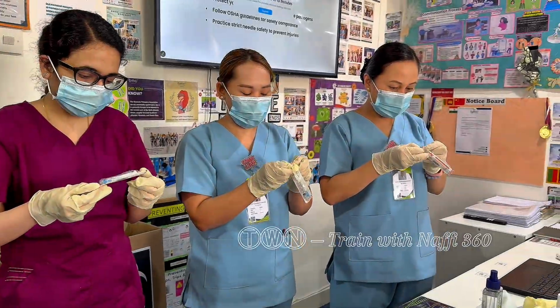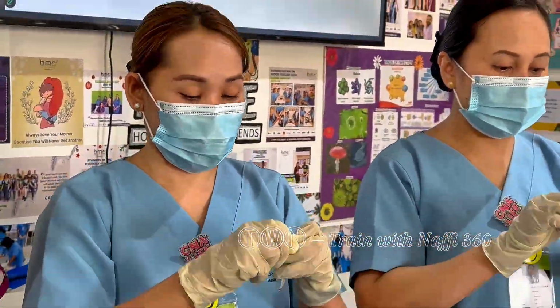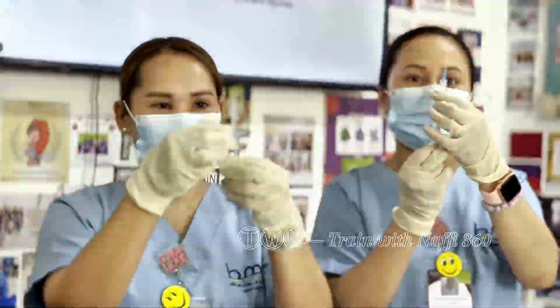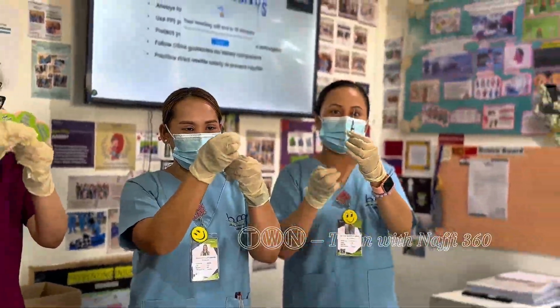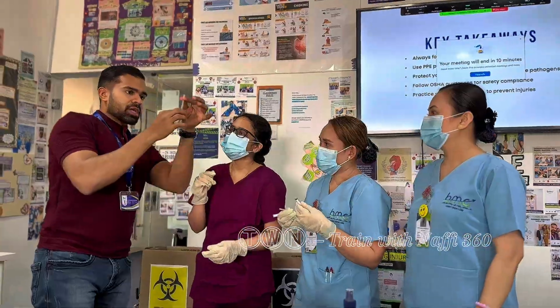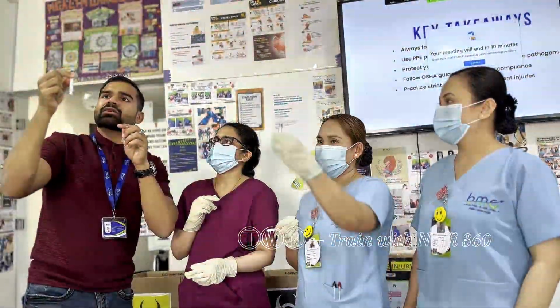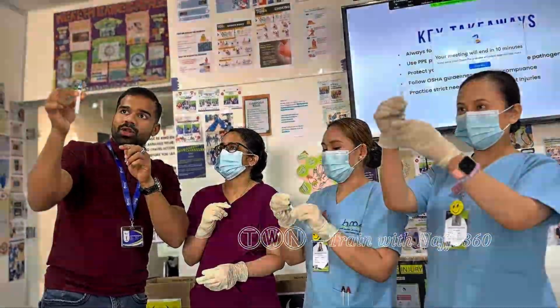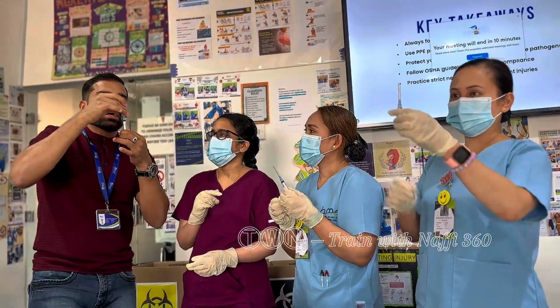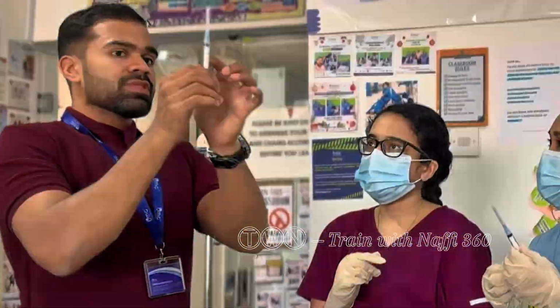Students are now opening the sterile needle packet carefully, making sure not to touch the needle tip to keep it safe and clean. Before using any needle, it is important to check it properly. Always look at the packaging to make sure it is sealed and not damaged. Hold the needle by the hub and attach it securely to the holder. Always make sure it is tightly fixed before proceeding. These checks are a vital part of patient safety and infection control in phlebotomy practice. Following these guidelines step by step will ensure proper safety technique during phlebotomy training.